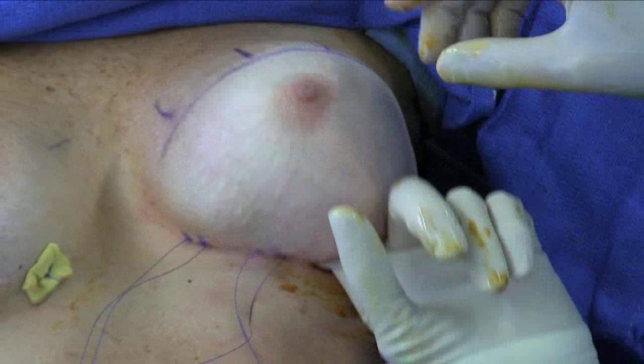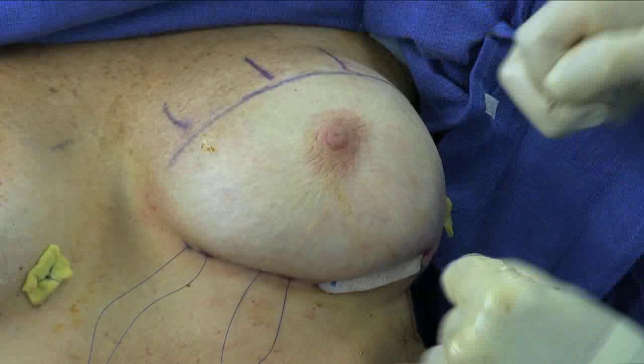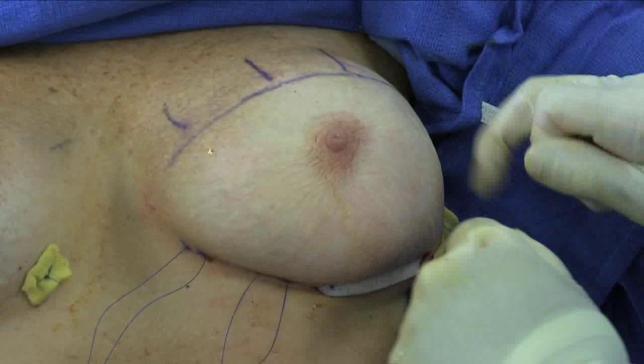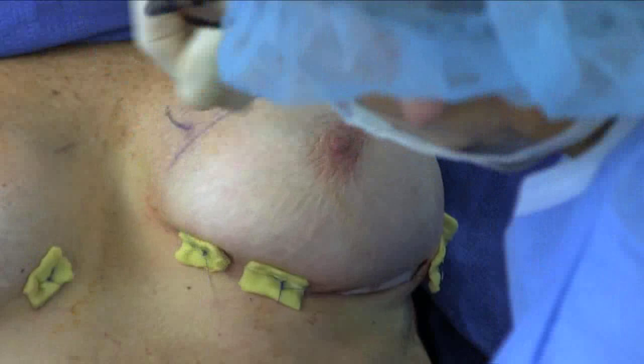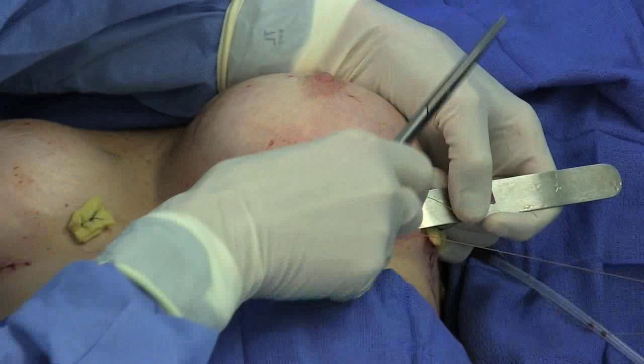The plastic sheeting is removed and the implant position within the pocket is checked, as well as making sure the ADM lies smoothly over the implant without folds or wrinkles. The bolster sutures are then tied. The ADM is then sutured to the lower portion of the incision to seal the implant pocket.